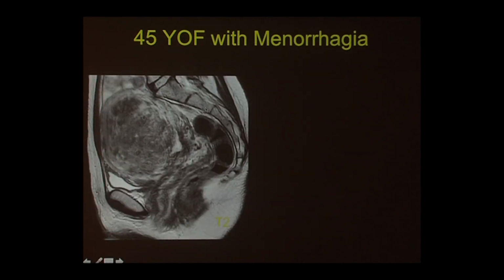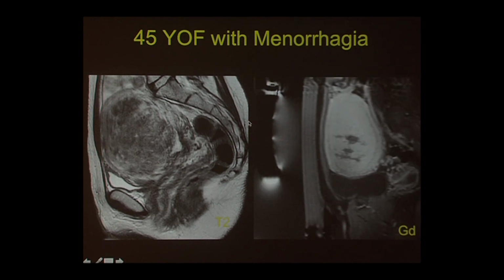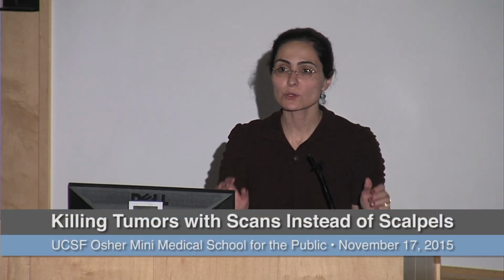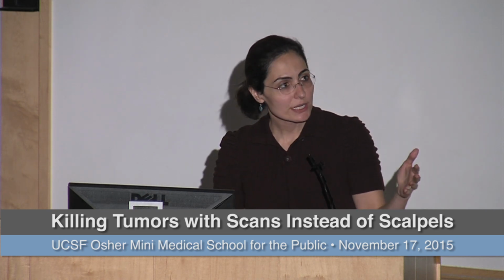Here's a patient who has a very large fibroid. Her fibroid's very heterogeneous. It's not dark. It's more what we call heterogeneous, because it has areas of darkness and it has areas of bright. And in this patient, when I was done with the therapy, she didn't do that well. So I was only able to burn a little bit of the fibroid. And as Dr. Bucknor said, some tissues respond really well, and it's really hard to anticipate that sometimes. But usually if you identify the best patients according to the characteristics that I showed you, you end up with a higher chance of successful therapy.